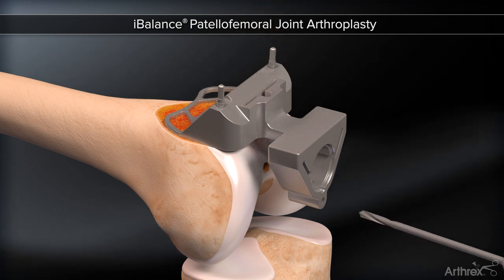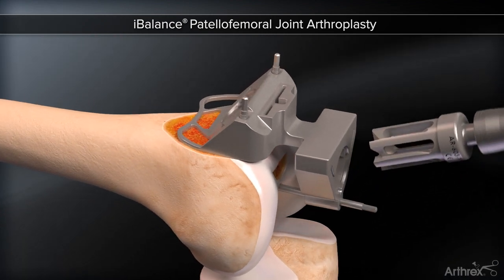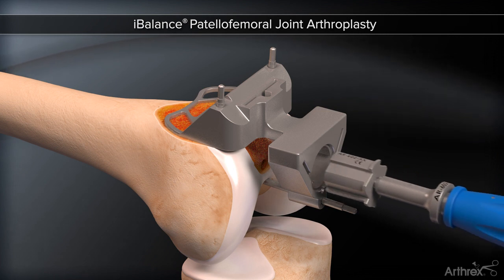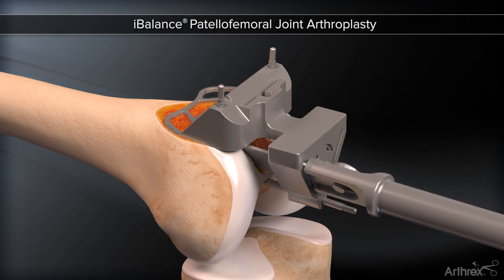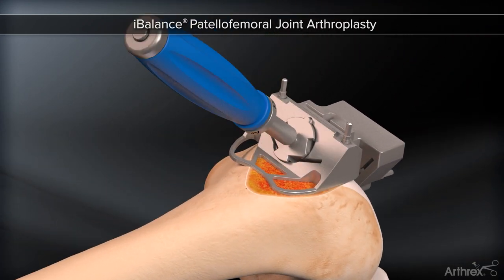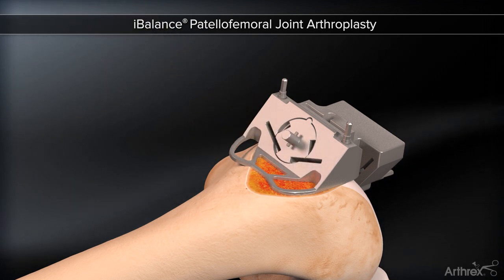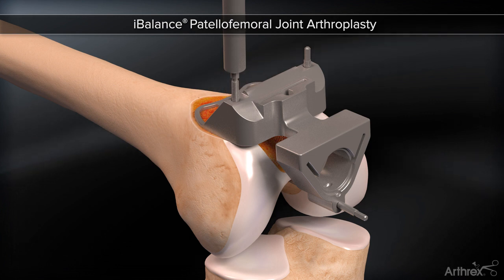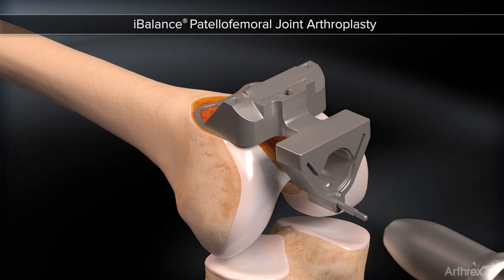An optional pin may be placed posteriorly for added fixation. Reamers are used to create the radius of the trochlear component, both distally and proximally. The radii created by the reamers are then extended using a series of guided osteotomes, first used distally. A final osteotome is used to create a clean-up punch in the middle. These single-use osteotomes are custom-shaped and hollow ground, maximizing precision on both the medial and lateral sides of the trochlea.